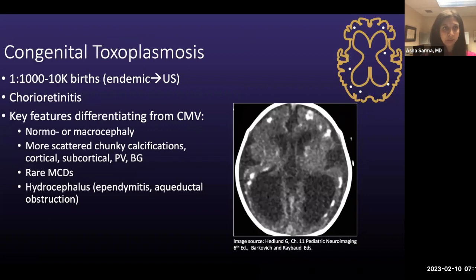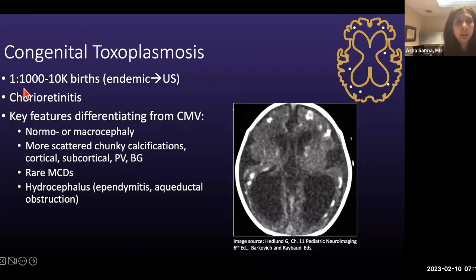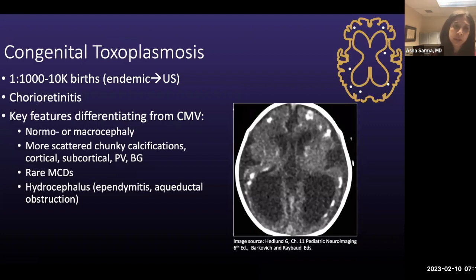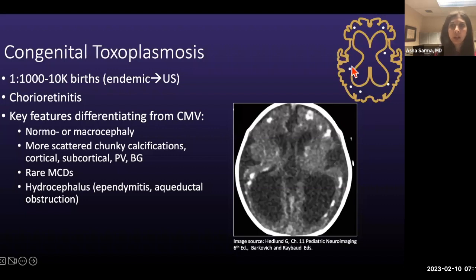Moving to congenital toxoplasmosis — more rare than CMV, especially in the US, but may occur in up to one in a thousand patients in endemic areas. An important clinical manifestation is chorioretinitis. Key features on imaging: rather than microcephaly, patients are normal or even macrocephalic due to hydrocephalus from ependymitis and aqueductal obstruction. The character of calcifications differs — you see cortical, subcortical, periventricular, and basal ganglia calcifications, unlike the purely periventricular pattern in CMV. Cortical malformations are rare; hydrocephalus is very common.